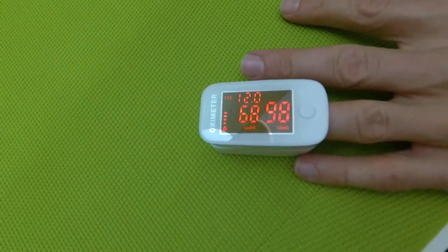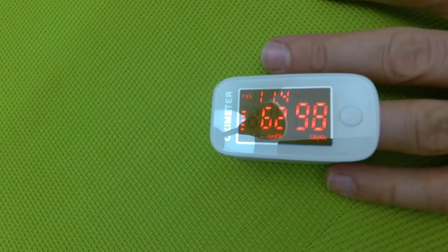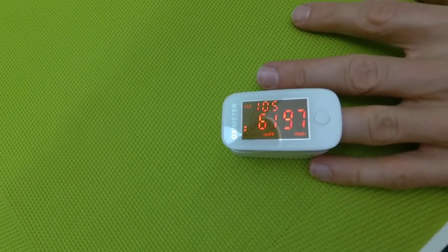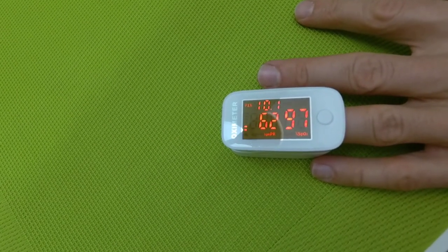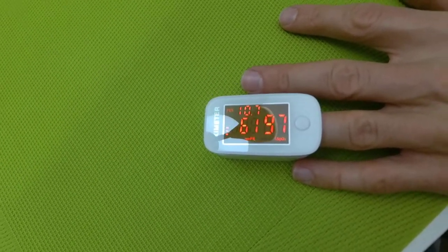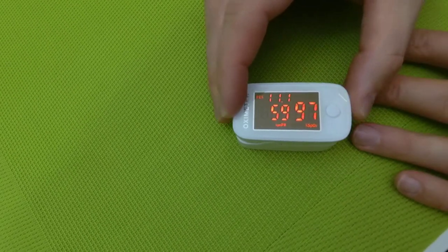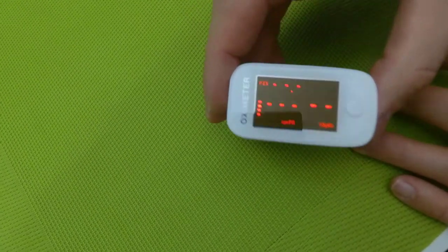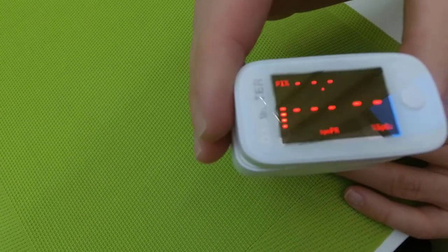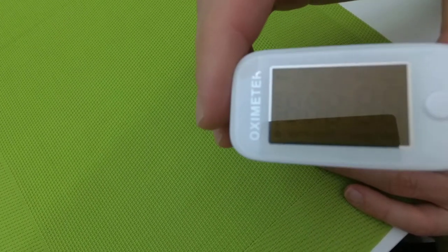Now, after a couple of seconds when we have steady readings on the screen, we can confirm that I have 97% oxygen saturation. To stop the measurement, I just remove it from my finger, and the measurements disappear, meaning the device is ready to turn off. You wait a couple of seconds and it's off.